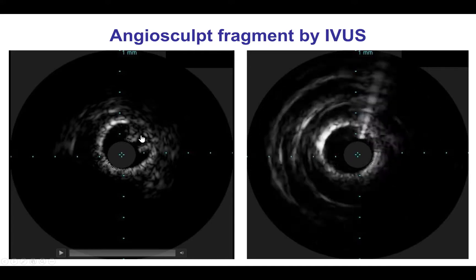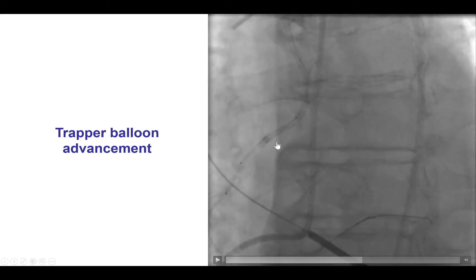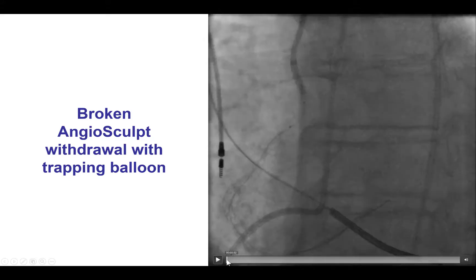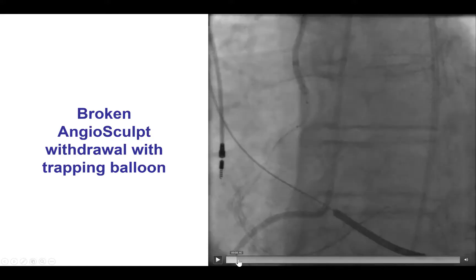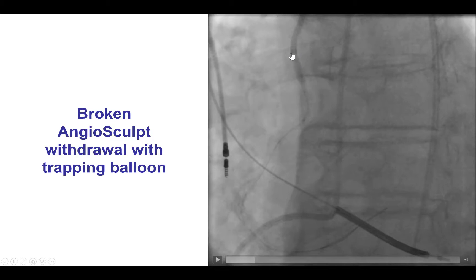This is actually good news, because when we know that, we can advance a balloon next to this fragment, inflate the balloon inside the guide catheter, which traps or anchors the balloon fragment inside the guide catheter, and then remove everything en bloc. So we advanced a 3.0 mm balloon, inflated it inside the guide catheter, essentially anchoring whatever part of the fractured balloon was inside the guide catheter, and then very slowly tried to remove it. To our pleasant surprise, the whole thing came back — the entrapped angiosculpt balloon came out nicely together with the guide catheter.